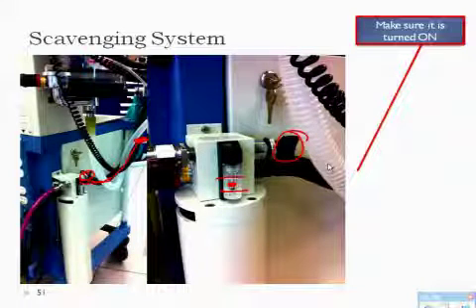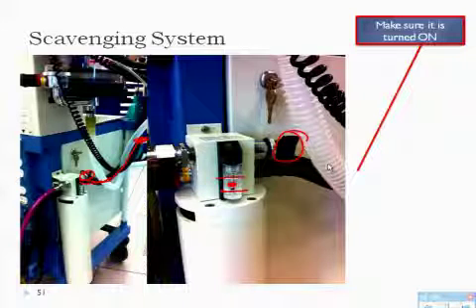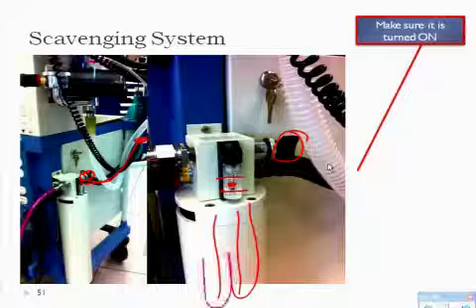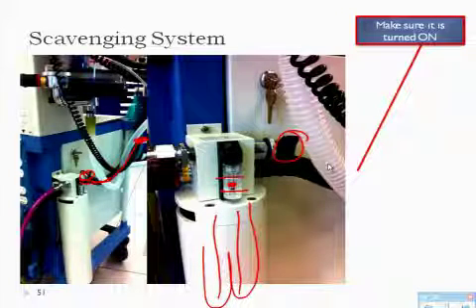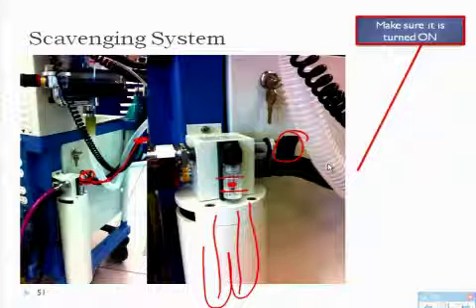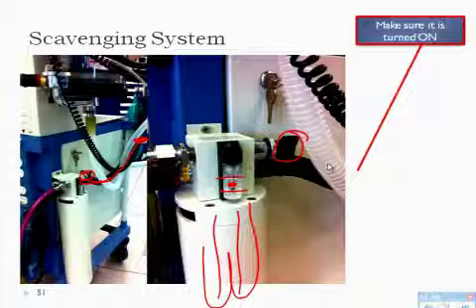This housing here, it's just an empty container. All right? So there's actually nothing in there. There's just some pipes in here that run along, and anyway, it just moves the air along so it doesn't go back into the system. Once it enters this, it's not coming back out. Okay, so you can't breathe against it.